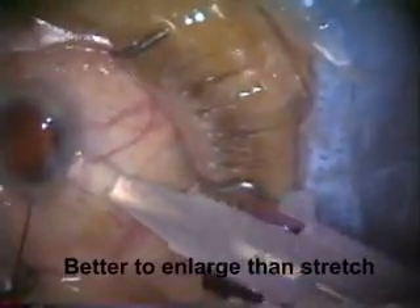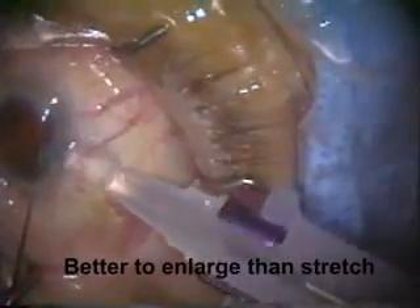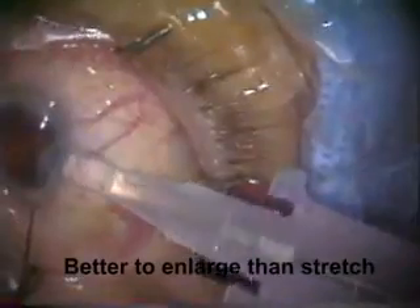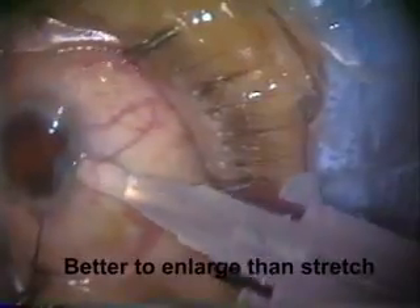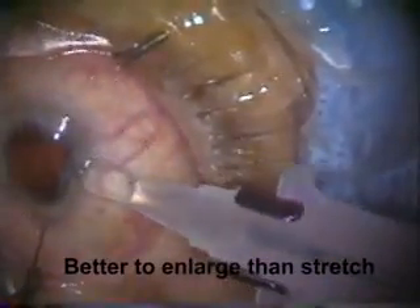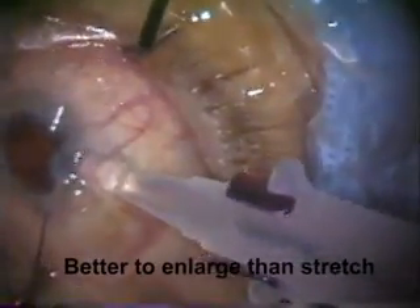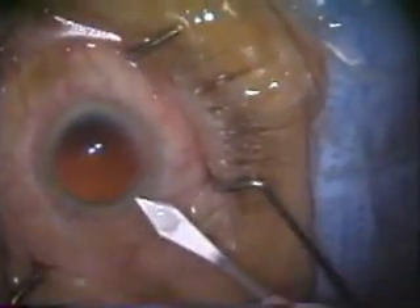Don't stretch the wound. It's much better to make the wound bigger with a knife than it is to stretch a small wound, as I'm doing here. I kept trying and trying and stretching, risking tearing Descemet's. And finally I did the right thing — I gave up on the stretch and simply made the incision bigger. This makes the incision far more likely to seal.